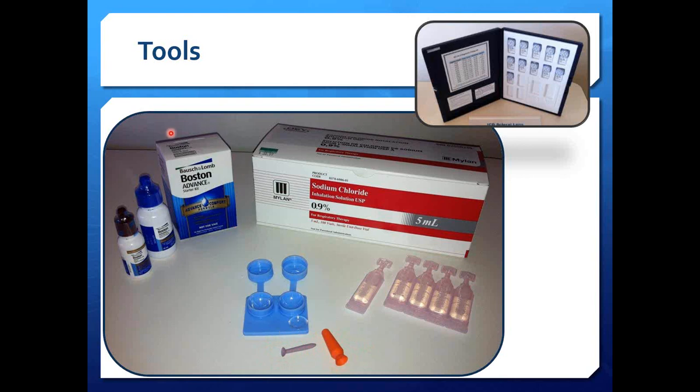Now we also need our GP fluid. Why? Because we want to do our surfactant cleaning with the GP cleaner, and then we store the lens overnight in our conditioning solution. What we don't kill with the surfactant cleaning hopefully will kill whatever bugs are left over with the overnight conditioning of the lens.